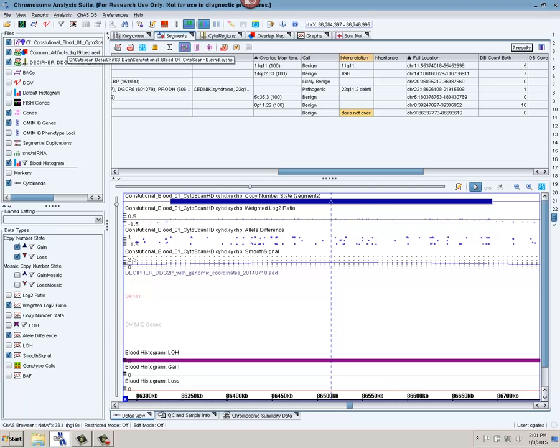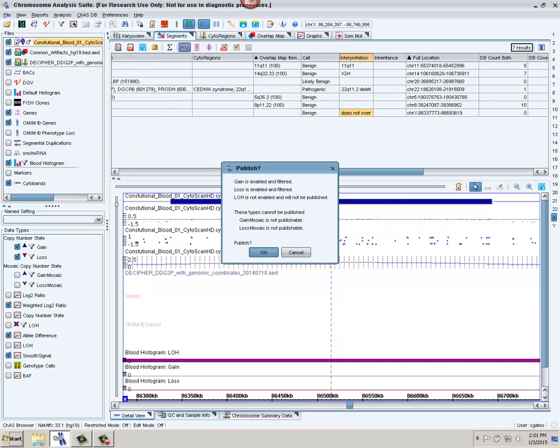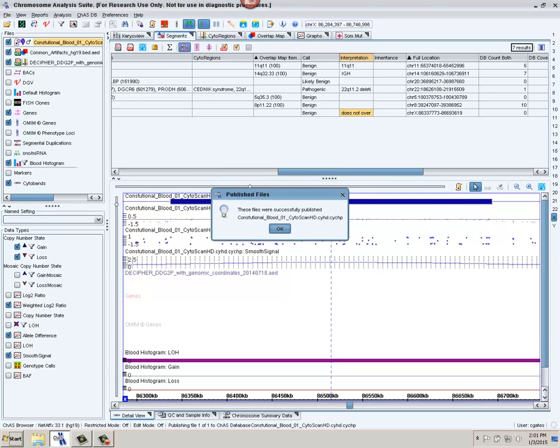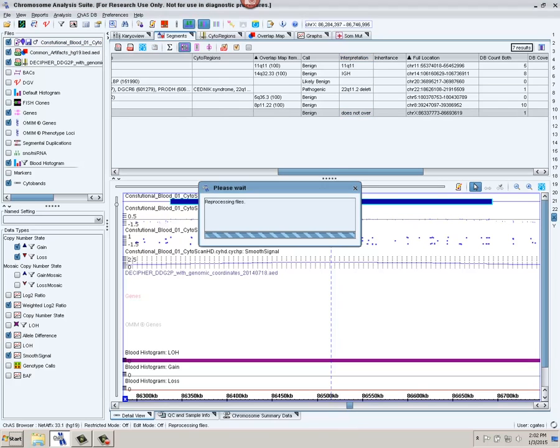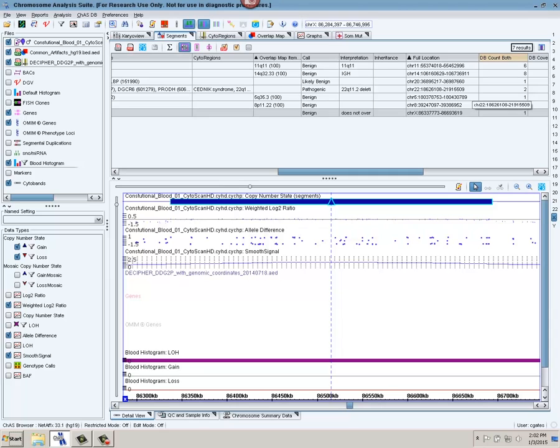I can now upload this file by right-clicking on it and choosing Publish File to Database. It's letting me know that the copy number segments will be uploaded. And I say okay. The files were successfully published. And we can see we get new counts here that are reflected immediately in the database count. So for instance, before I had seen it one time, now I see this segment, this pathogenic segment, twice because it's counting this sample that I just uploaded.